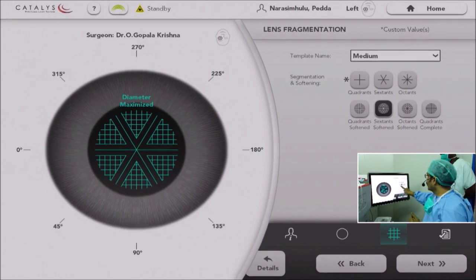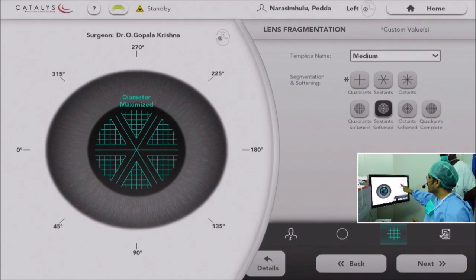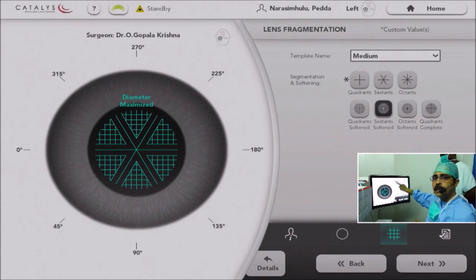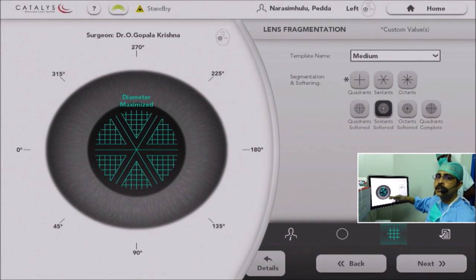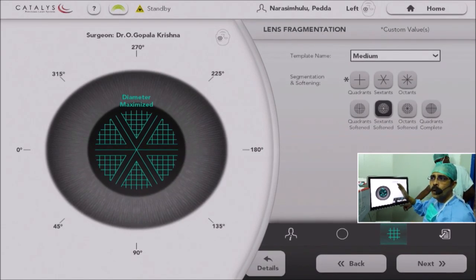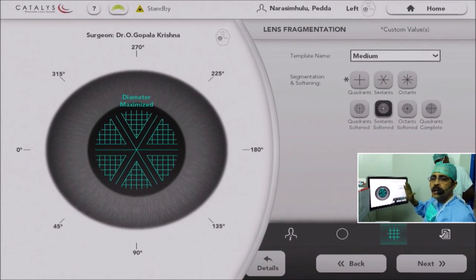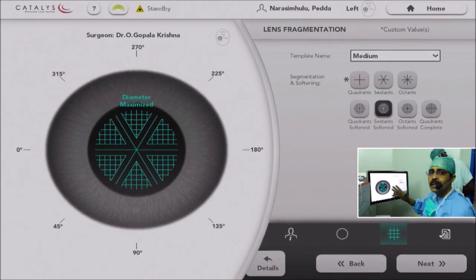Additionally, you can soften each quadrant. Suppose you are making 4 quadrants — you can soften each quadrant with small cubicles. That lessens your phaco energy. That is the beauty of the femto laser cataract-assisted surgery. The reason why you want to offer FLACS is to reduce the amount of phaco energy and phaco time, which is detrimental to the corneal endothelium in some cases.